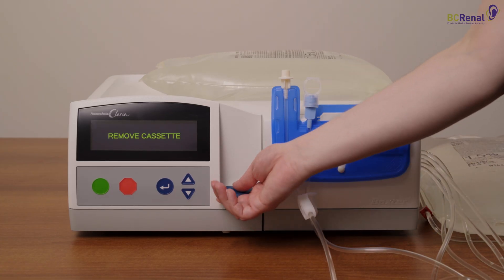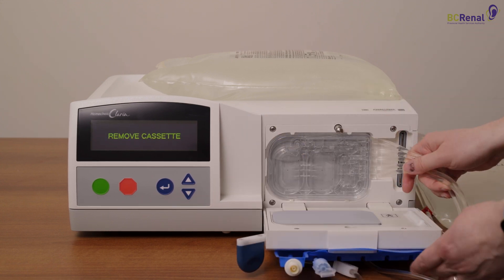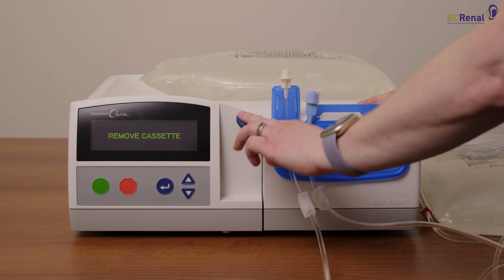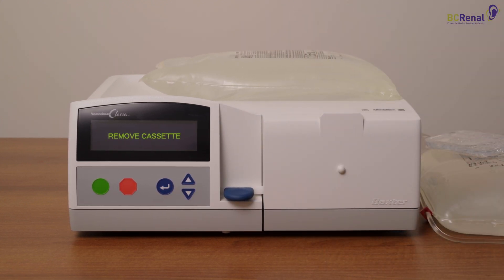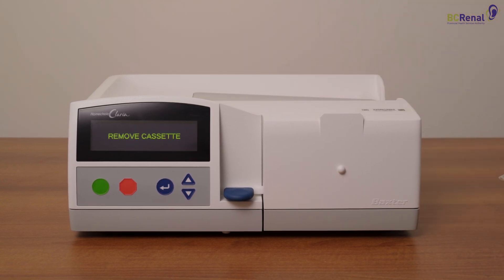Open the cassette door and remove the used cassette, lines, and solution bags. Examine the solution in the drain bag for clarity. The solution in the drain bag can now be emptied into the toilet, tub, or shower. Discard the used supplies in your household garbage.